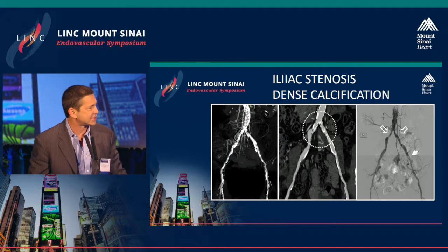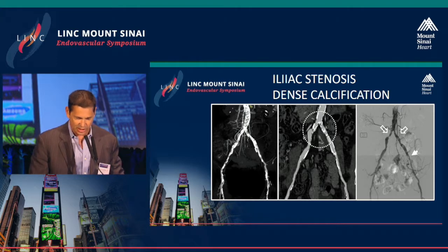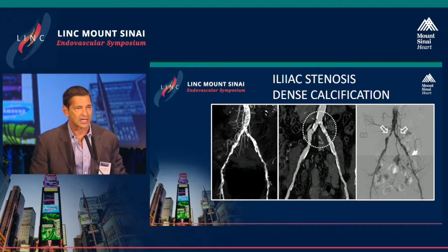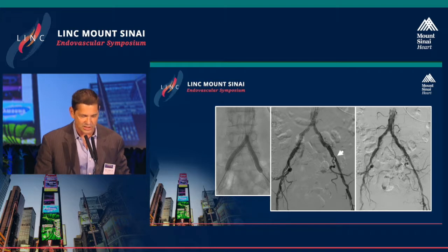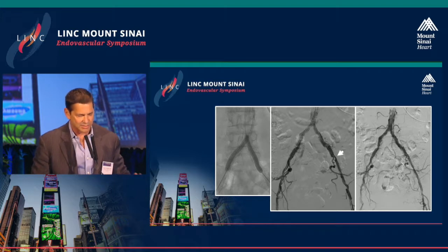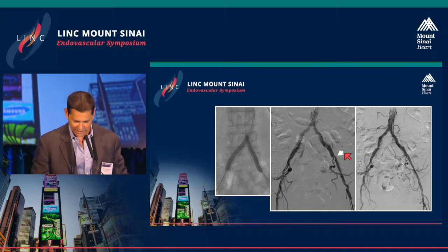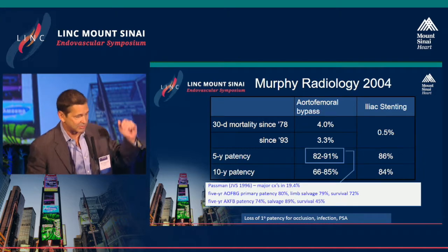Switching over to the iliac side of complex aorto-iliac interventions — this case is not complex except that we're dealing with very dense calcification, which is ubiquitous in our aging population with chronic kidney disease and a lot of diabetes. This is a nice indication to use stent grafts in case of rupture. These are cases where you want to pre-dilate gently and avoid overexpansion of the stent, as we did here with a satisfactory result. There's a little external iliac lesion just below the hypogastric — gently dilate that and accept an imperfect result because of dense calcification. You can always return on another day for additional intervention as needed.